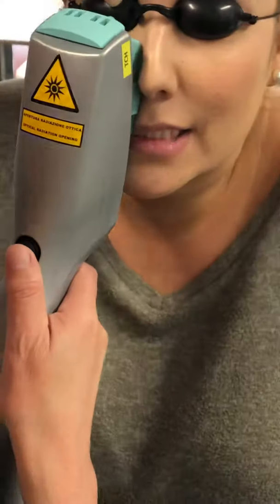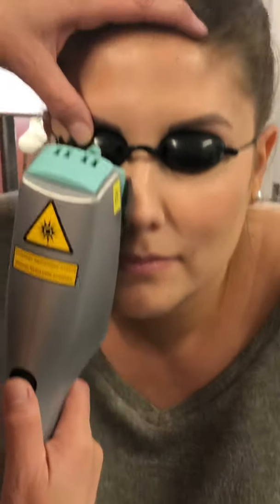Whenever we're doing a patient, maybe just let me see the red light, because that's where I was like, I didn't know what I was doing. Jump. Like I told you, it'd be the brightest light you'll ever experience. Oh, so should you close your eyes then? Yeah, squeeze your eyes tight. Patients will usually close their eyes. Sounds like a little vacuum. Alright, here it comes. Okay, you're about to see a bright light.